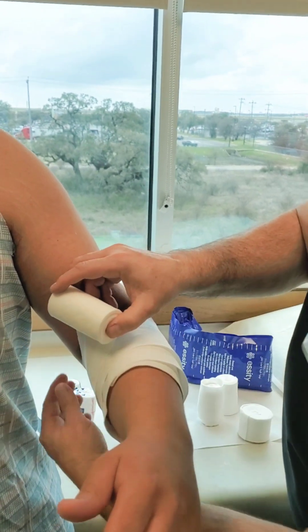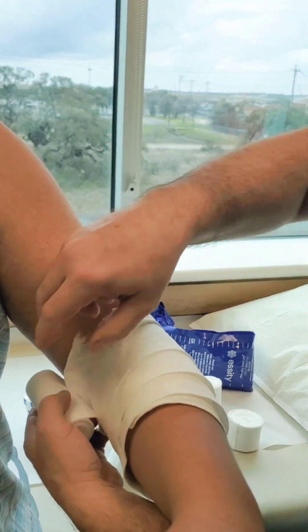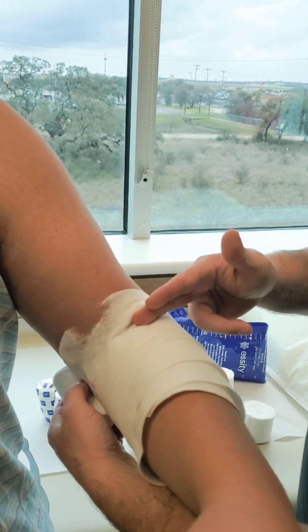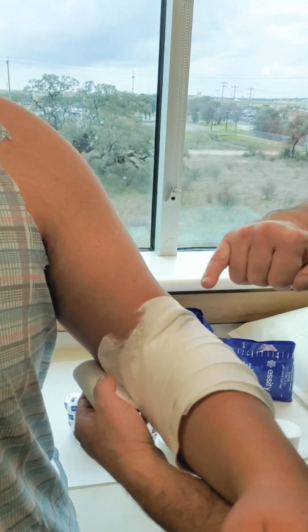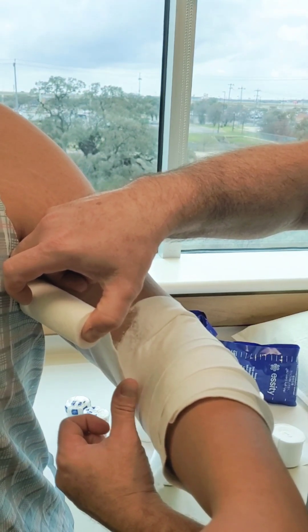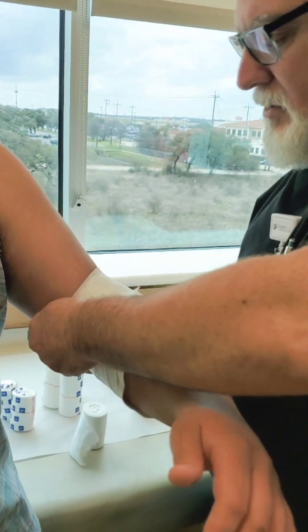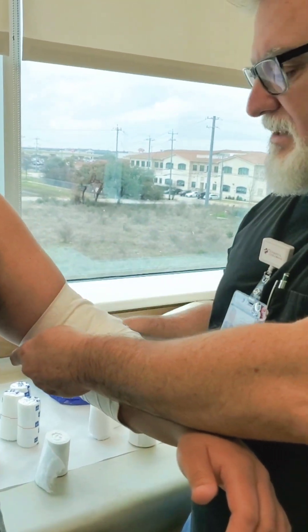When I get to the crease, I like to shear the padding off so it doesn't dig in — some people prefer to cut it. The key thing everyone agrees on is that when you come to a bend — whether at the elbow, armpit, or knee — you never use the edge of the padding, fiberglass, or ace wrap. You always use the middle. We'll time-lapse up the arm to save you a couple minutes.